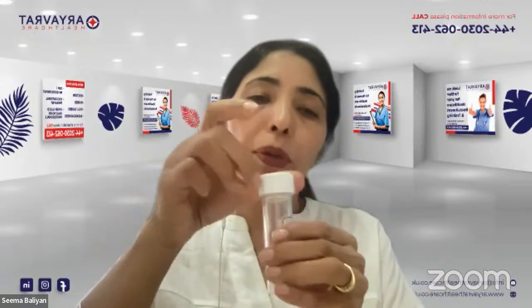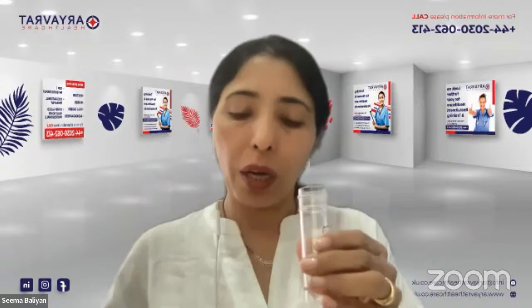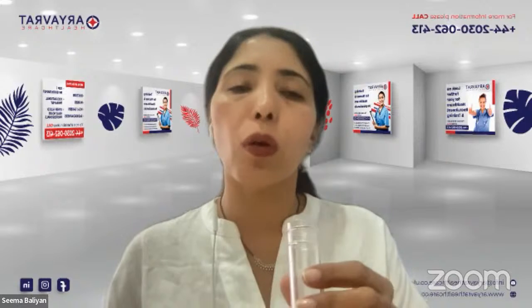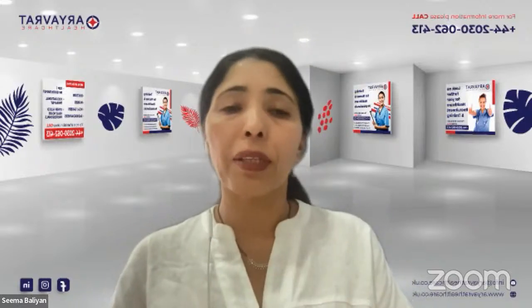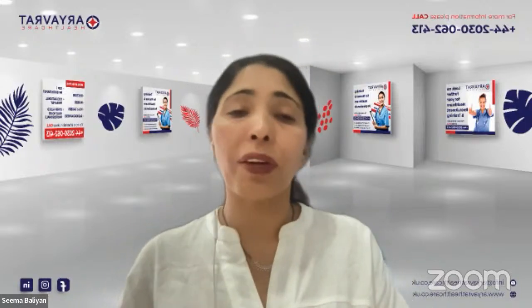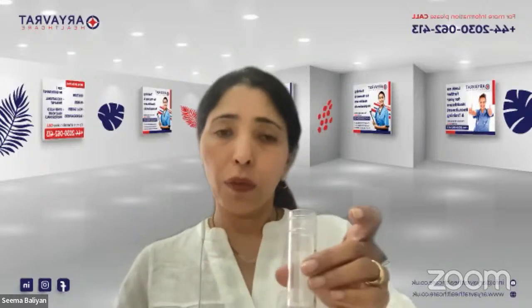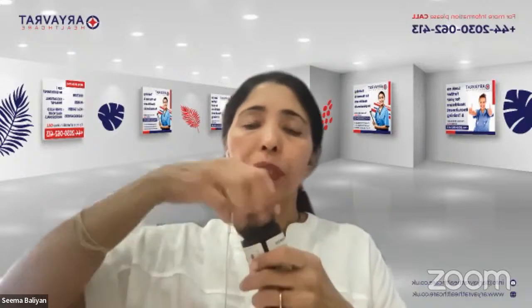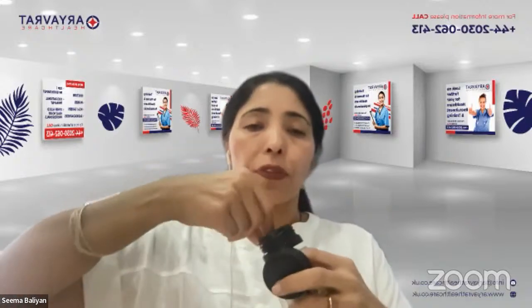After that, you are going to be opening the bottle, and when you open, you can just sniff. You can say that it is smelling normal. Sometimes, if there is a presence of ketones or something, it can smell very fruity. Once you have done that, then you are going to open it and keep it, and you are going to be taking out one strip of the reagent strips.